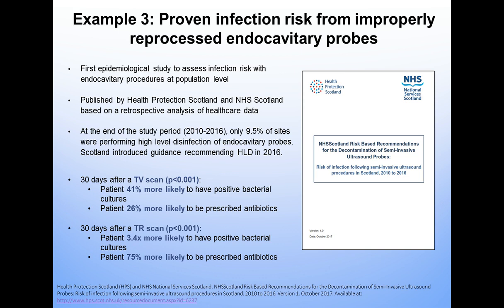So quite a lot has happened this year. In October, the organisation Health Protection Scotland, which is a government-funded agency in collaboration with the NHS Scotland, the Public Healthcare Authority in Scotland, ran this study. Merle mentioned earlier that a patient had died in 2012 from a transesophageal ultrasound procedure.